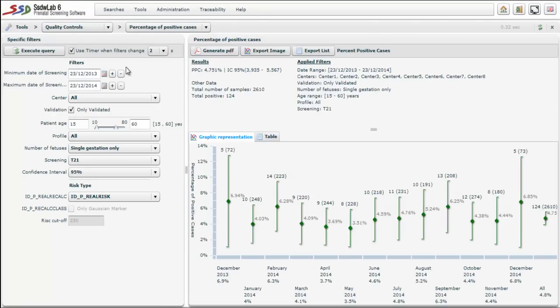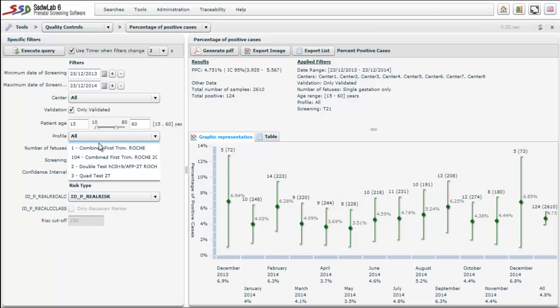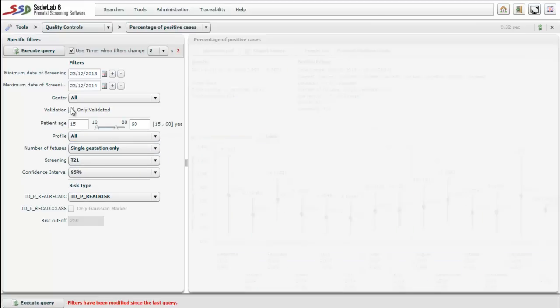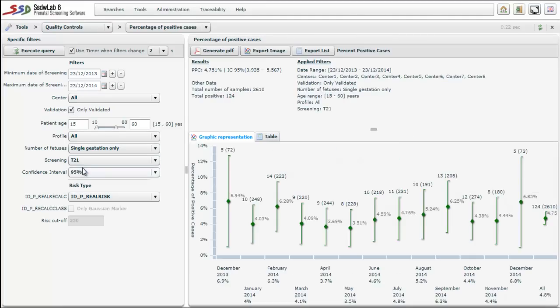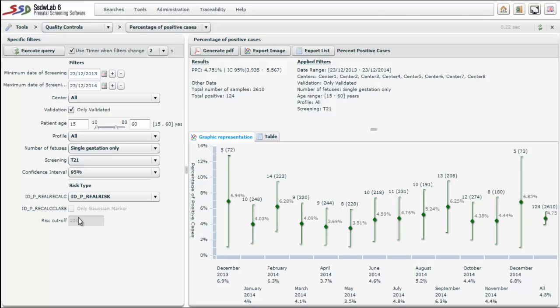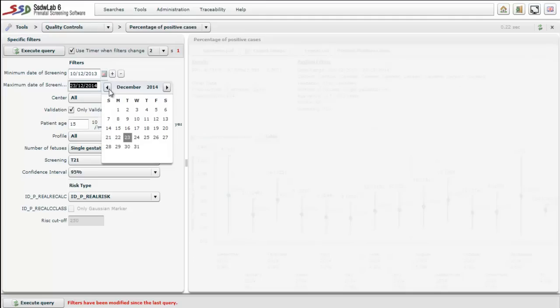A screen appears where on the left side we can observe different controls. We can select the profile which analyzes the percentage of positive cases — in this case for all screening profiles. We can define if the cases have been validated or not, if we analyze only trisomy 21 or all trisomies, and choose singleton pregnancies, twins only, or all pregnancies. We also set the cutoff level, for example 250, and the date interval for assessing the percentage of positive cases.